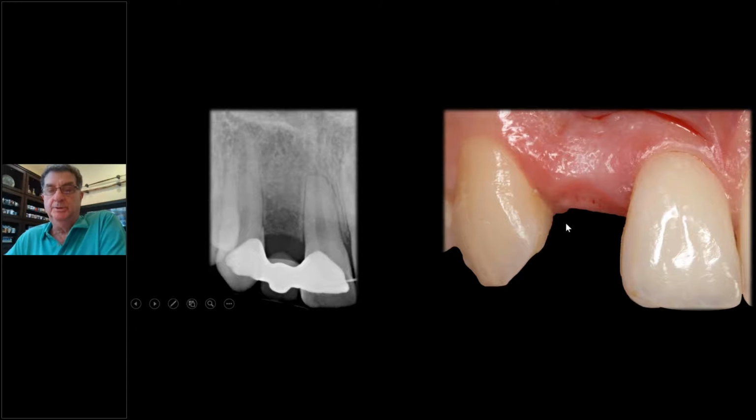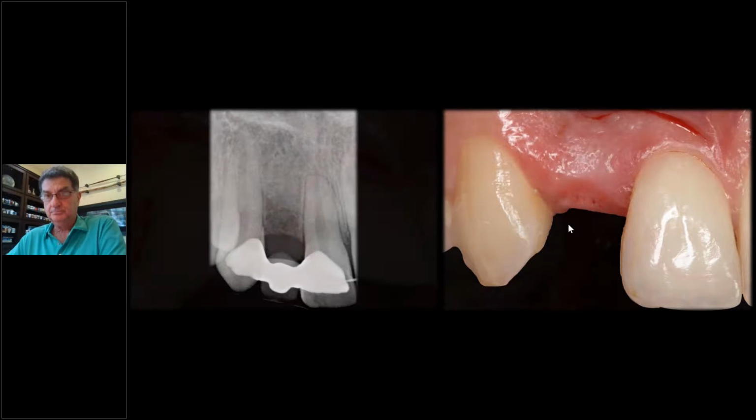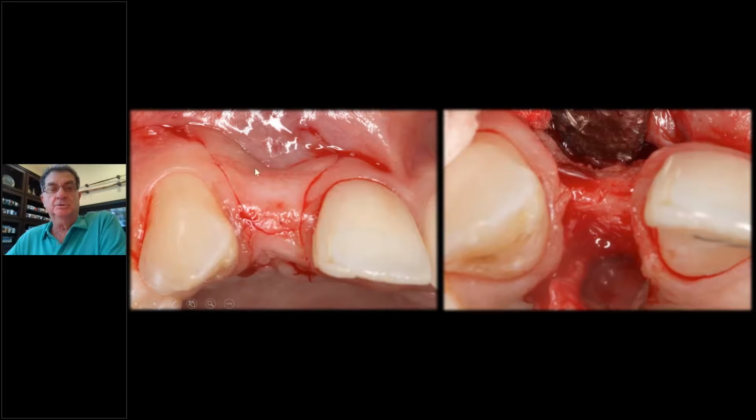Mid-facial, you can rebuild, as long as the height's there. So here's the depression, as you see now. Now this is what a papilla sparing incision looks like. I know he talked about a keloid, but it's really not a scar, it's a depression. Gingiva does not scar.